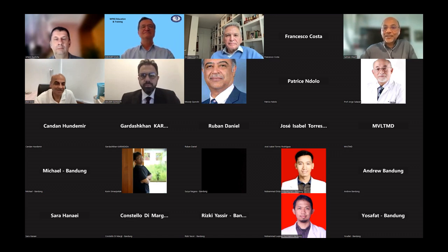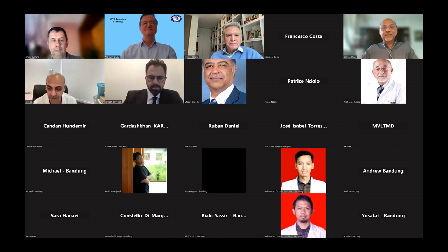Atul, your thoughts? Enrique, that was a very fantastic lecture, and your surgical techniques that you showed were very masterly, like I have seen in the past. Endoscope is an emerging tool. Maybe it is not emerging anymore, it is an emerged tool, and people like you have promoted it to a great extent.